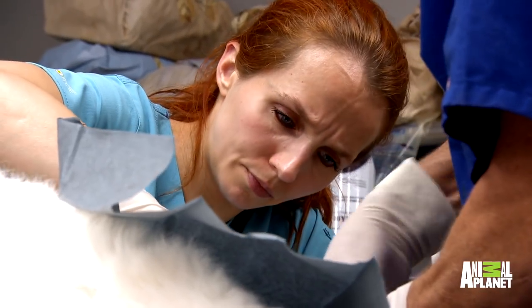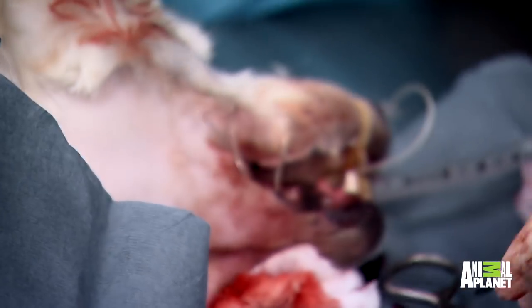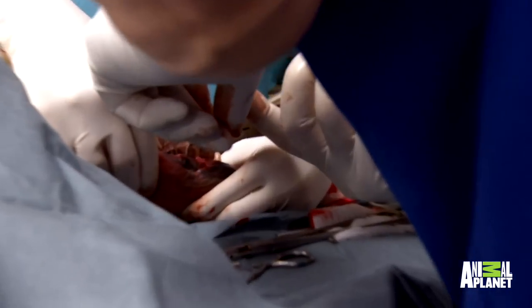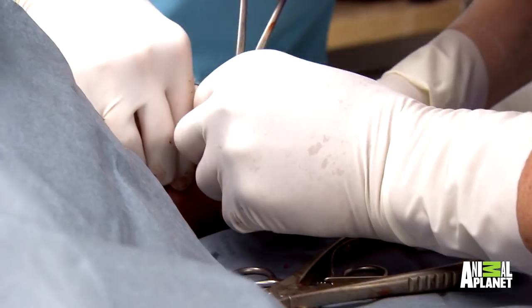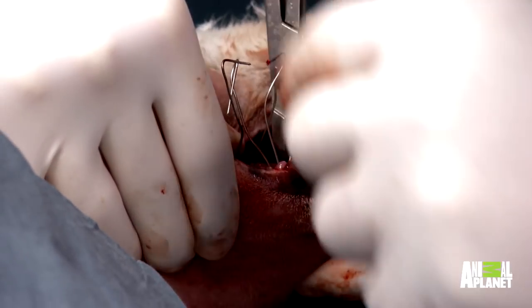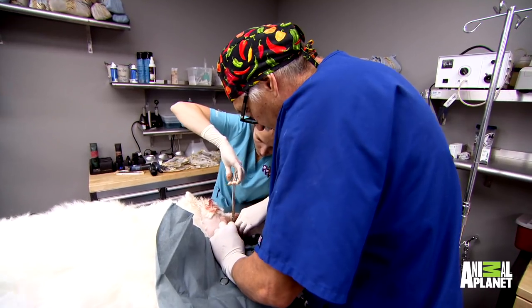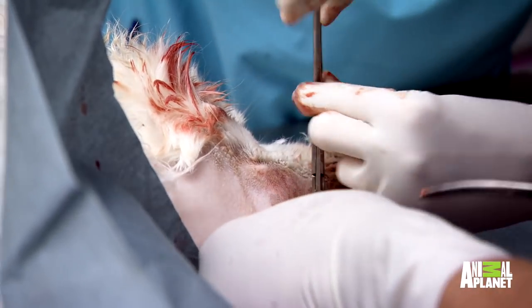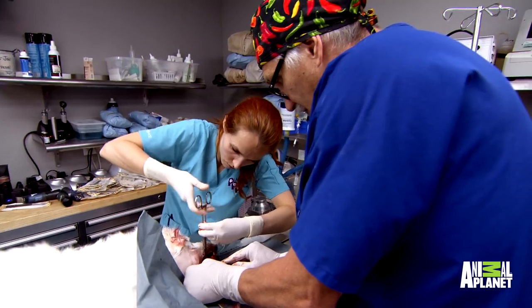Okay, got it — that's one way down. Got it — that's three. I'm concerned about cranking the wires down too tight and having that bone just split on me. Let's carefully tighten this one down. I just don't want to crack it in half — if we crack it the other way, we're screwed.